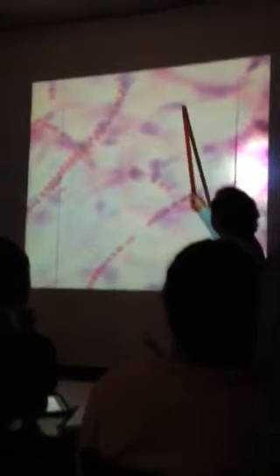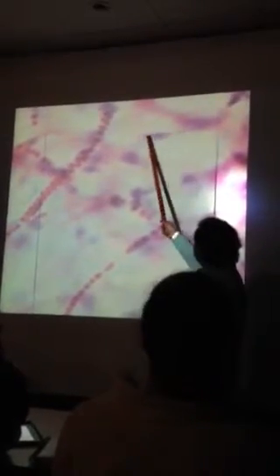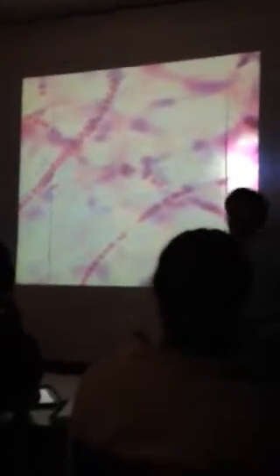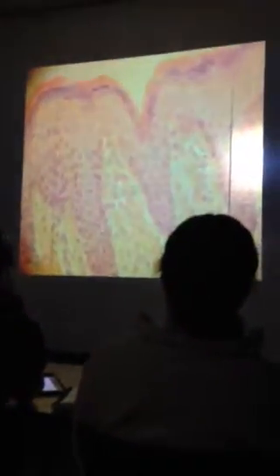You can also see, here's a fibroblast. See the fibroblast up there? Kind of stretched out. So remember, this is loose connective tissue. Remember, the mesentery has a loose connective tissue framework. All right, what are we looking at?